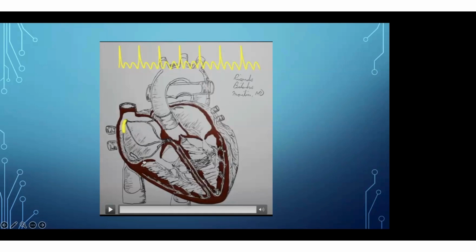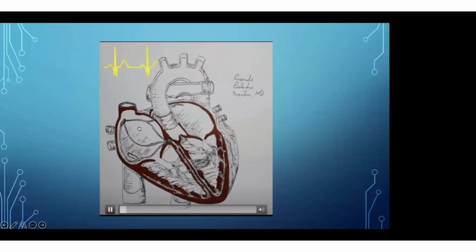Through that scar, there will be a normal sinus, and the normal area around that scar will conduct impulses like this, and they form a circuit, and the tachycardia is ongoing. Tachycardia will be fluttering like this, so multiple atrial beats, P waves will be there, followed by 1 or 2, 3, or after 3, one will go down through the AV node and conduct as a QRS. So this is the circuit of one type of atrial flutter.